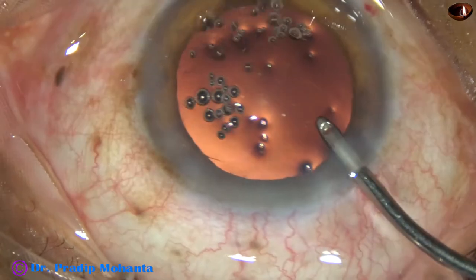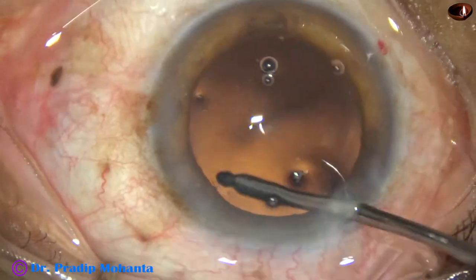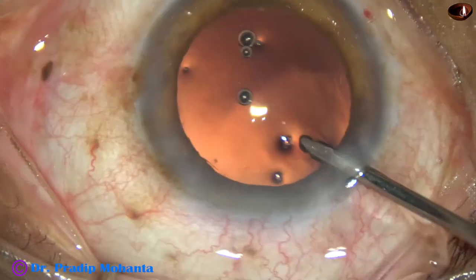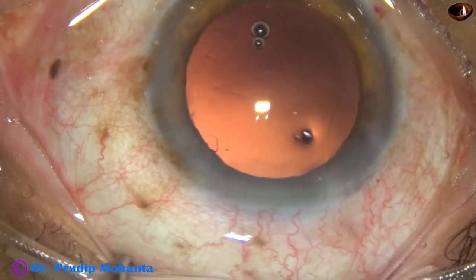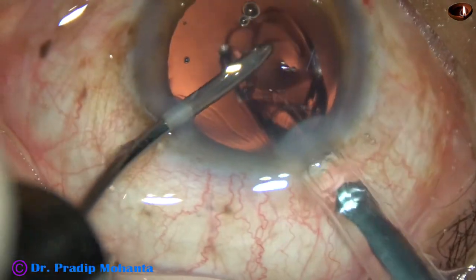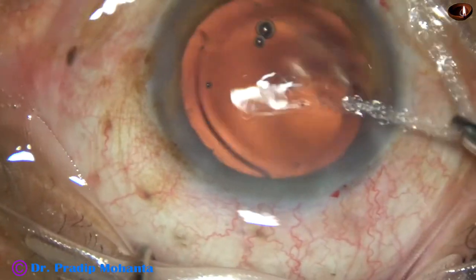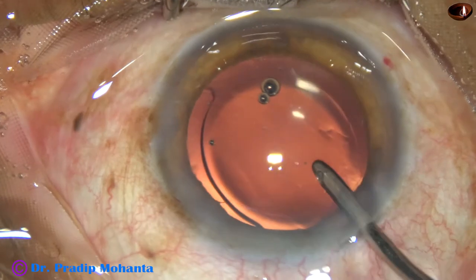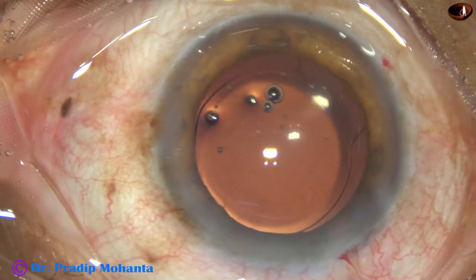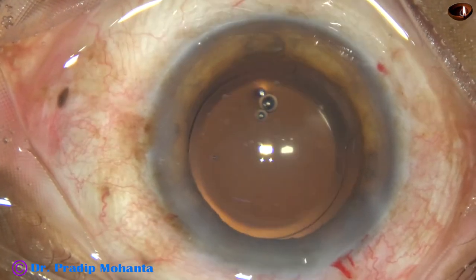Now this is hydro polish. Whatever lens fibers are there, they are just irrigated out. The posterior capsule appears clean, and now under irrigation a monofocal single-piece intraocular lens is implanted in the capsular bag. We can even implant multifocal or toric single-piece intraocular lenses under irrigation — particularly useful when implanting toric IOLs where we don't want to use OVD.